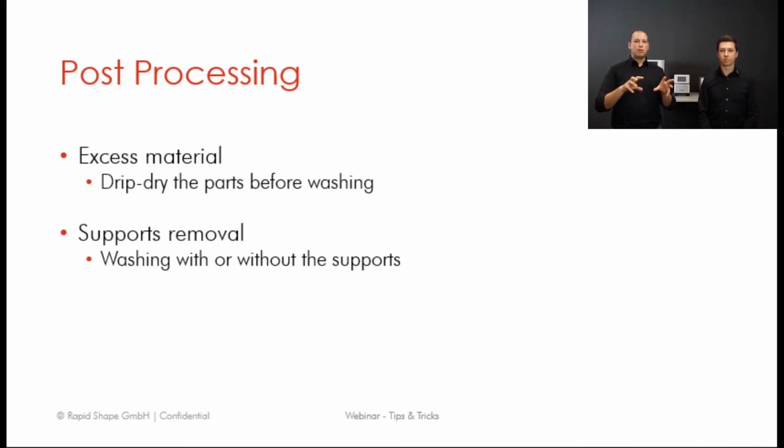You can put it in the machine, start it, and then go back to the previously printed job, at which point the majority of the liquid resin should have drained away from it. This is one way of doing it, because it also takes less maintenance in the post-process, with less IPA exchange for the washing and so on.